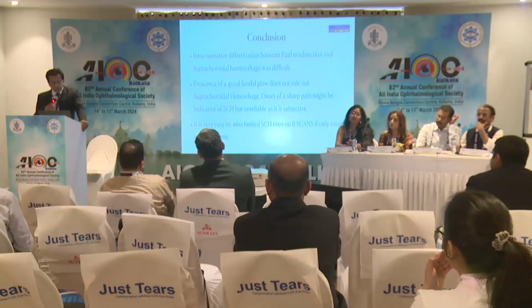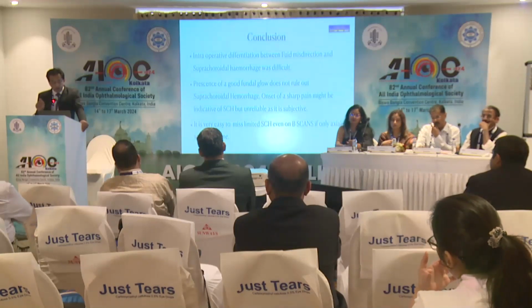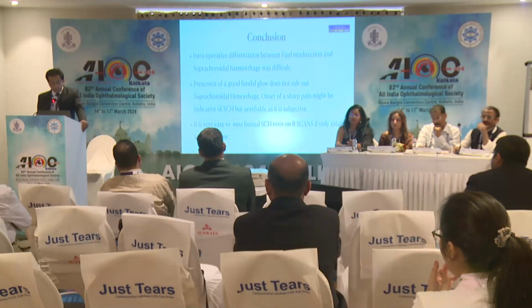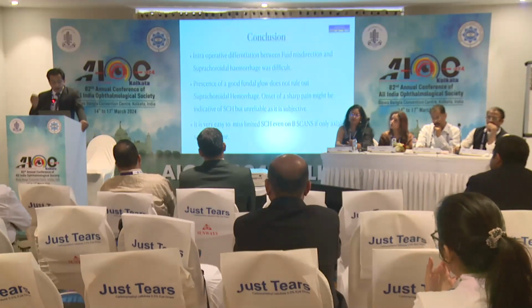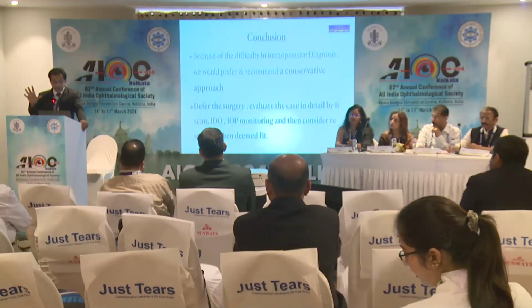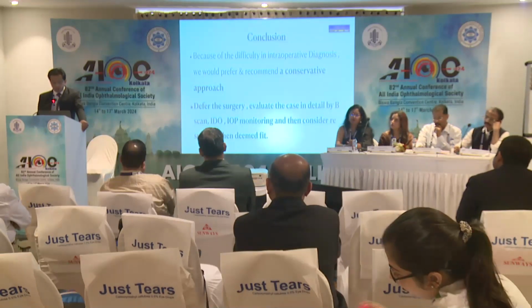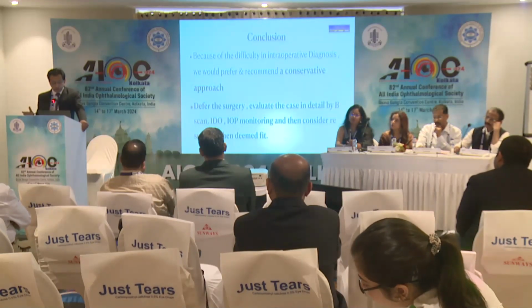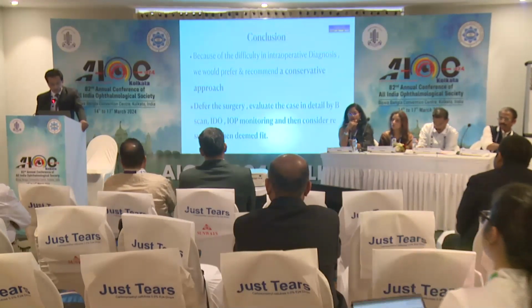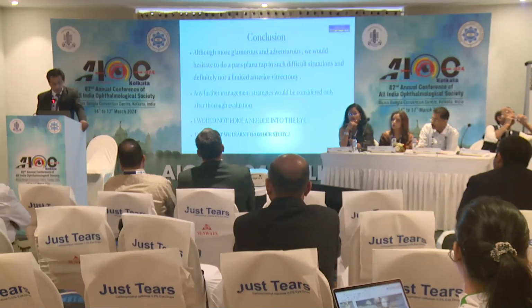It's very difficult to differentiate between fluid misdirection and suprachoroidal hemorrhage in the OR, because good fundal glow was seen in all cases. And you can't rely on sharp pain because it's unreliable and subjective. It's very easy to miss a limited SCH if you just do an axial B scan. So because of this difficulty, we would recommend and prefer a conservative approach. There's no point in doing it on the same day. Defer the surgery, evaluate the case in detail by B scan, IDO and IOP monitoring, and only then reconsider surgery when deemed fit.